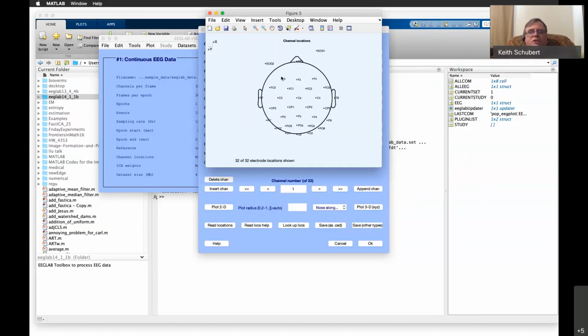And you can see for each of these, there's the prefrontal, the frontal central, which is between these two. The original 10-20 system just has the main ones. And then as they added more detail, they added a row between the central and the parietal, called CP, and between the frontal and the central, called FC. You can see the occipitals in the back, temporals along the sides. So it gives you an idea of these.